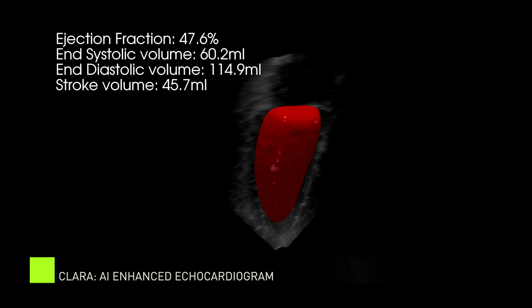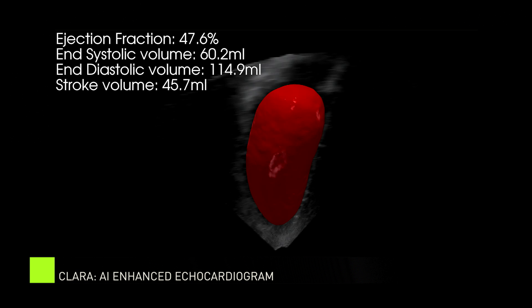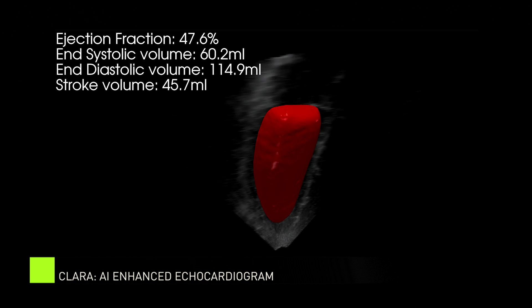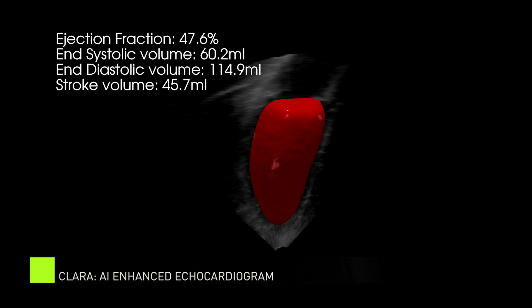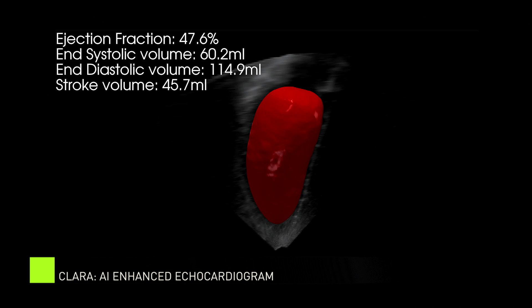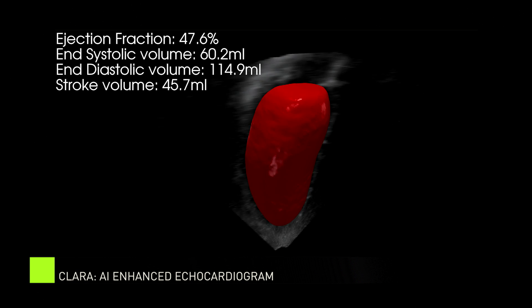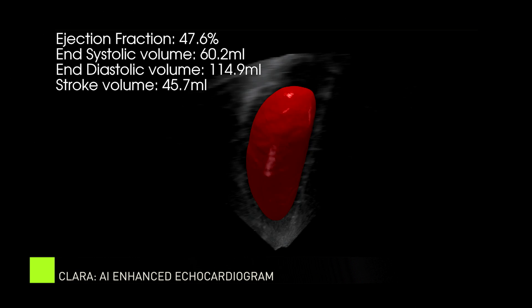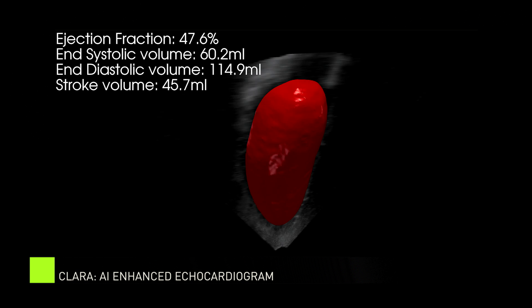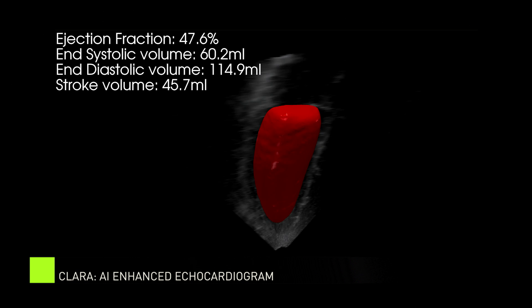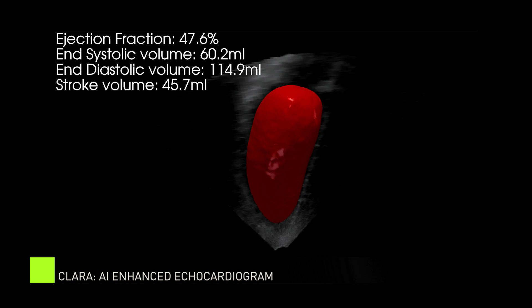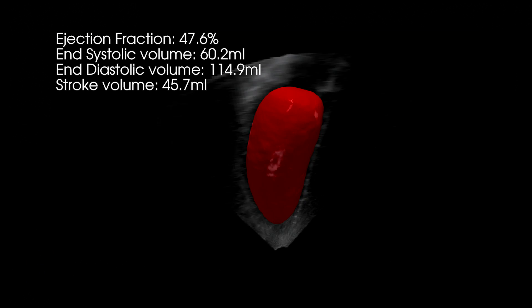Of course, the acoustic window needs to be of sufficient quality to allow the delineation of the entire left ventricular cavity endocardial border. As you can see, this visualization transforms echocardiography images from a grainy 2D picture into easily interpretable 3D images, adding literally another dimension that doctors can see when viewing echocardiograms and making interpretations more intuitive.